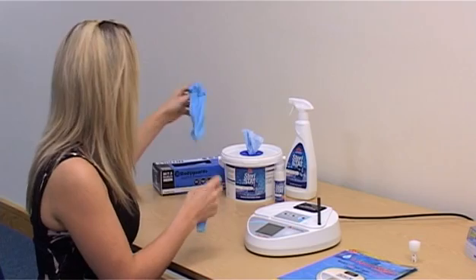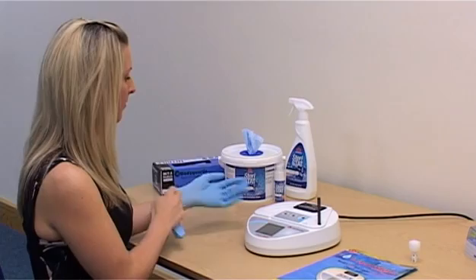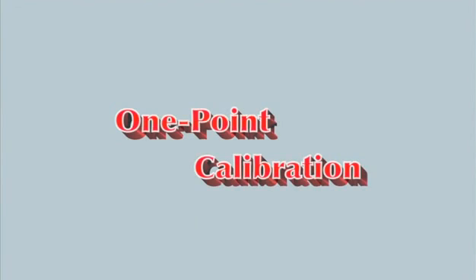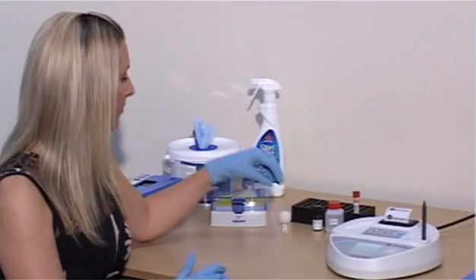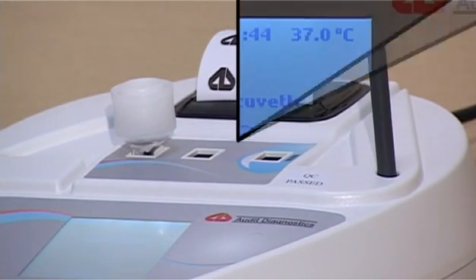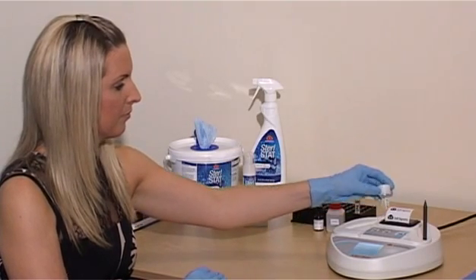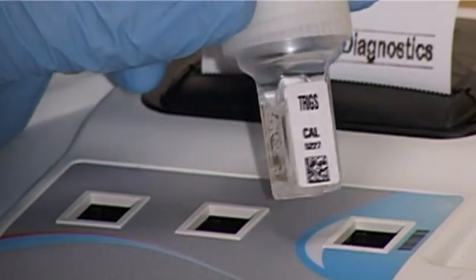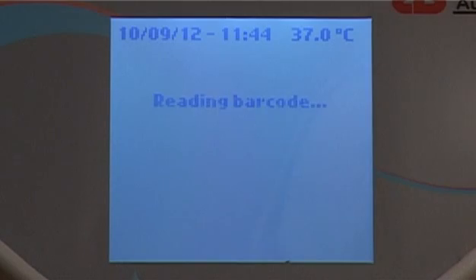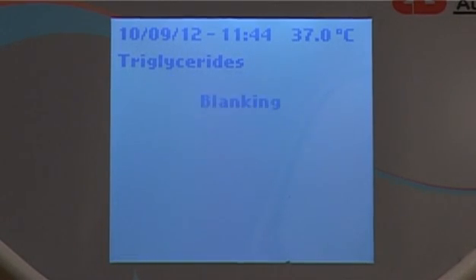Before running a patient sample, a calibration for the test needs to be valid. There are two types of calibration depending on the test: one point and two point. For one point calibration, pre-warm the cuvette in the incubation chamber for two minutes. To start the test, insert the CAL cuvette into the reading chamber, ensuring the barcode is facing towards the right. The Liquistat reads the barcode, automatically recognises the calibration, and performs a reagent blank.